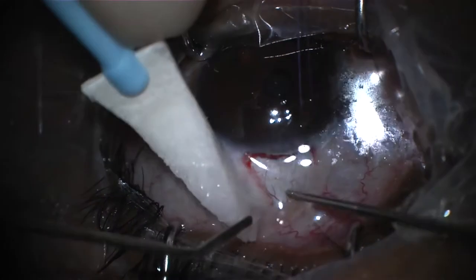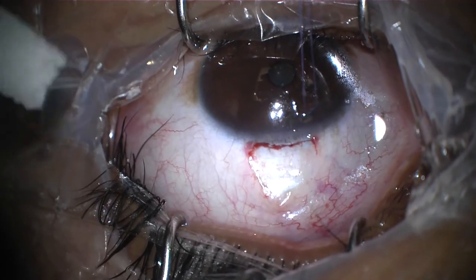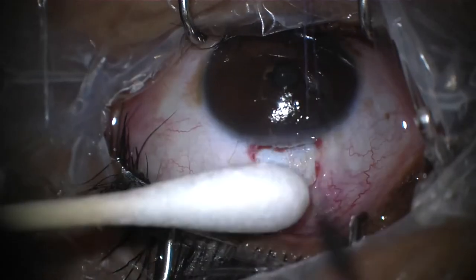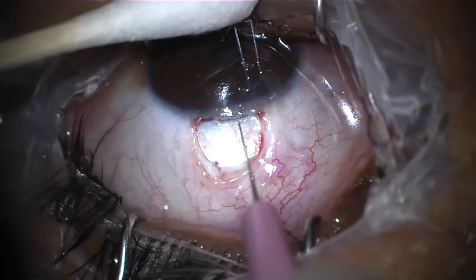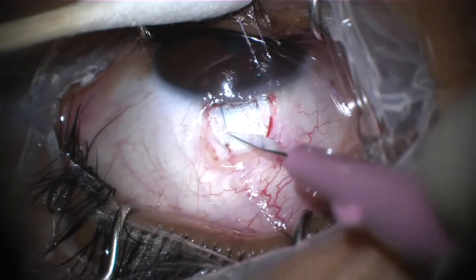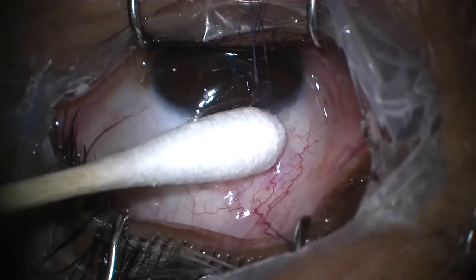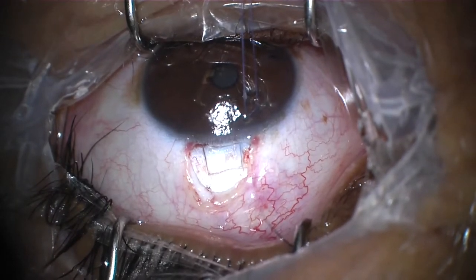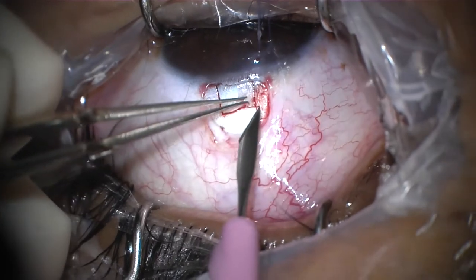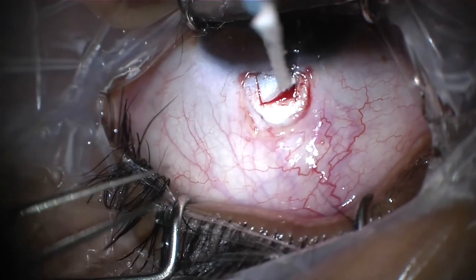Cauterizing the vessels in the area where we are planning to create a scleral flap. Using a 22.5-degree blade or 15-degree blade to create a half-thickness scleral flap.